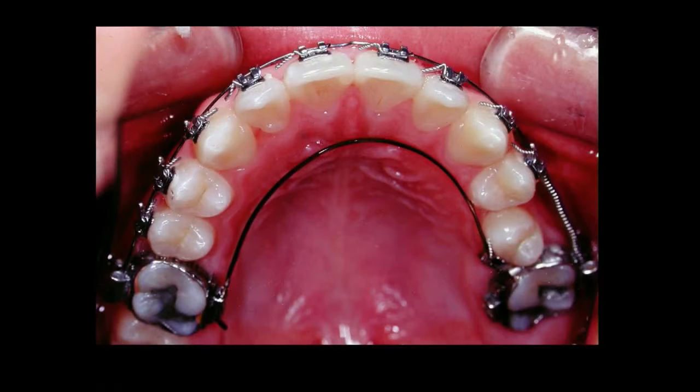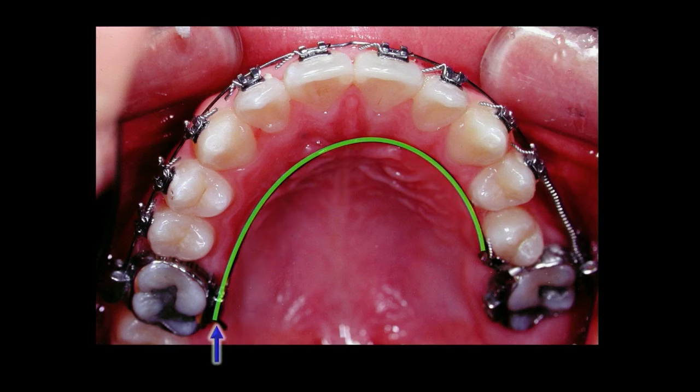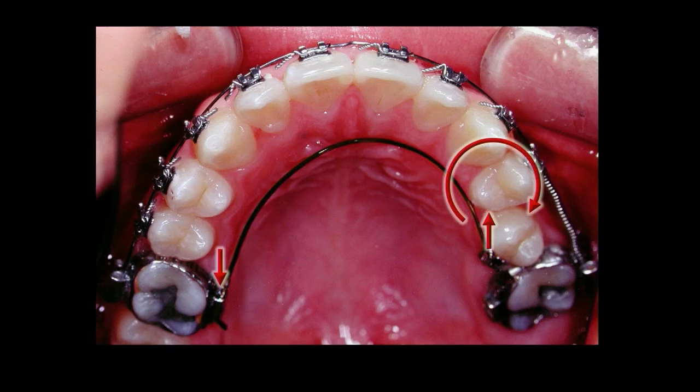For correction of badly rotated single tooth, a better solution would be using lingual arch rather than equal and opposite force pitted against adjacent teeth. A bracket was placed in unusual manner, however. It doesn't matter to apply a couple. As we activate the lingual arch like this, large moment would be produced on the target tooth with very little mesiodistal forces because moment arm is very long.